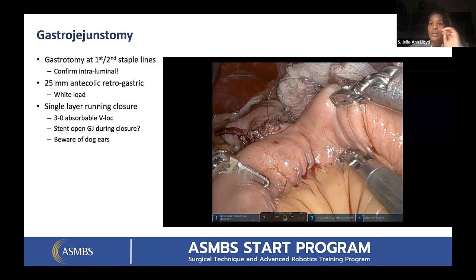And I always start in the corner that you mentioned, going towards the liver, because I think that is where the patients tend to leak. I stented over the bougie to do the outer layer, and I go past where the anastomosis ended. So I usually suture up that back wall and run it all the way across and go past the anastomosis again. It takes me a little bit longer, but like I said, I definitely roll over multiple times and stay asleep just fine.